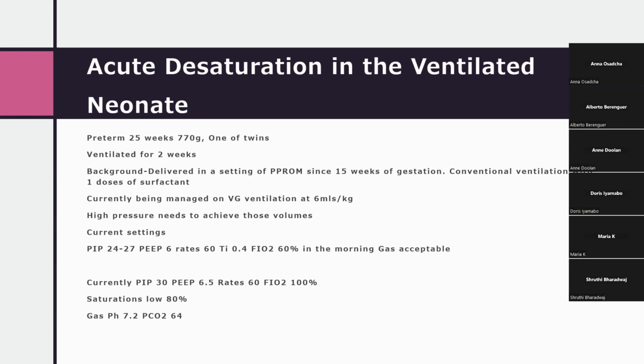So what we're going to do is look at this case, and in particular, we're going to focus a little bit on some history, some images. We're going to talk a little bit about the quality of the images and how you feel they are. But really, what we're then going to do is mentally model and think about pathology and how we might want to intervene.